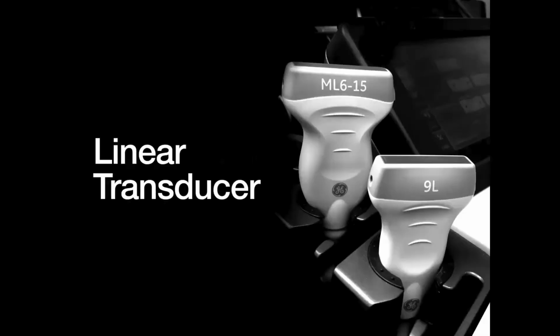So first and foremost, machines and knobology, right? This is the fun, geeky part of ultrasound. So you're going to want to use the linear transducer. If you look at the ophthalmology setup, they have a very specialized high resolution transducer, they call it the B scan, but for their ultrasound. And that transducer, they can do it in a number of different ways.